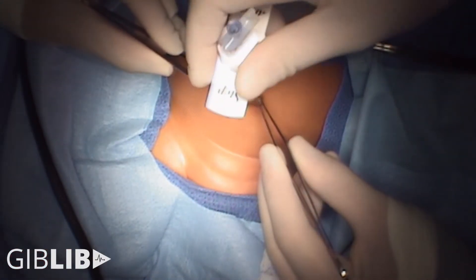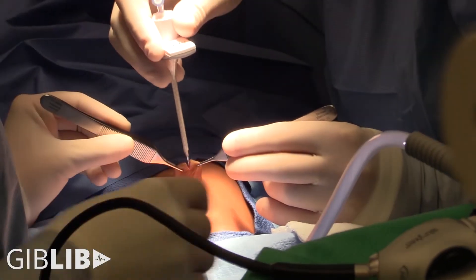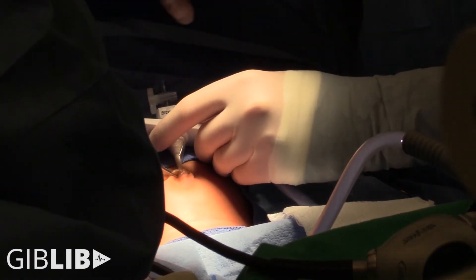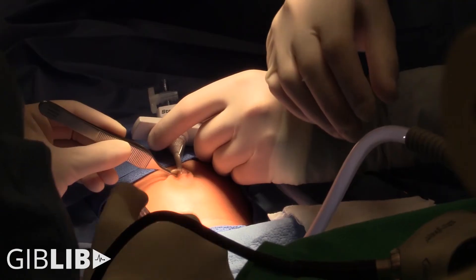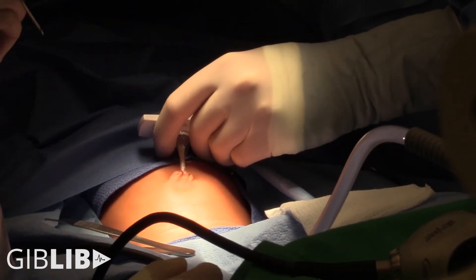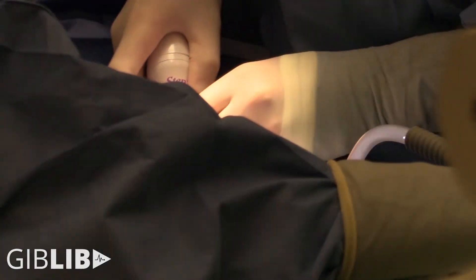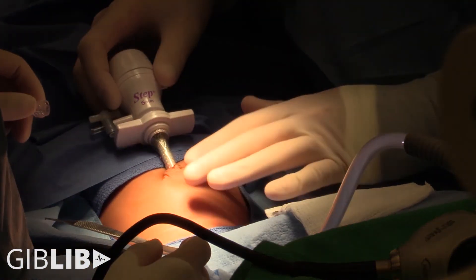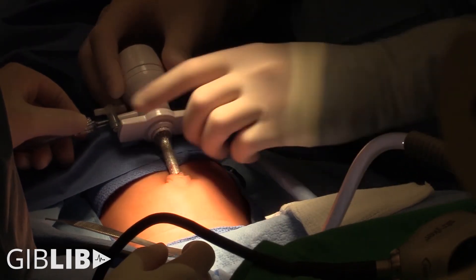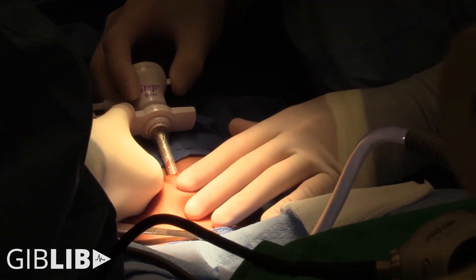We'll take a 3.0 silk on an RB1 please. Gas on, laparoscopic light on. When you're going through a pre-existing umbilical hernia, the port just doesn't stay very well, so we'll just suture it in — it makes everyone's life a lot easier for this case.